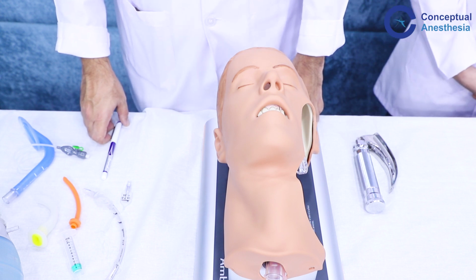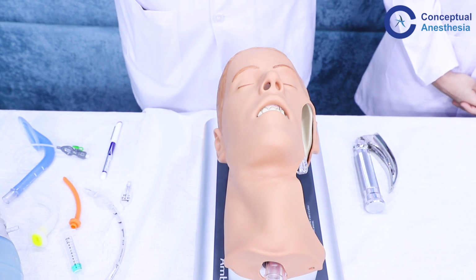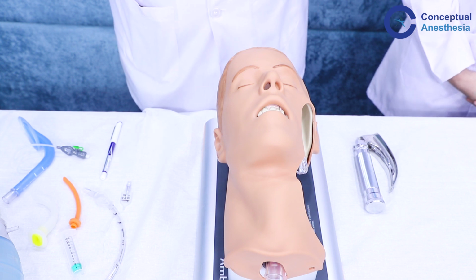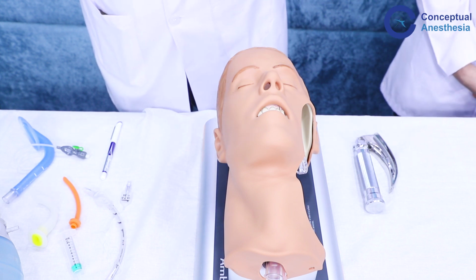Why? Because if you are not able to intubate this patient and it is an unanticipated difficult airway, we quickly need to move on to the next step so that the patient does not become hypoxic. So our next step will be to insert a supraglottic airway device to maintain ventilation and oxygenation in the patient.